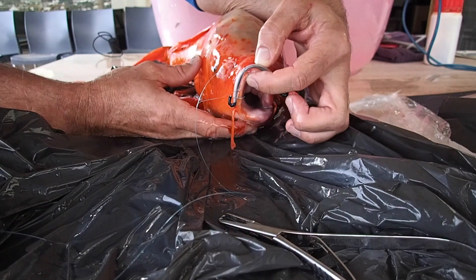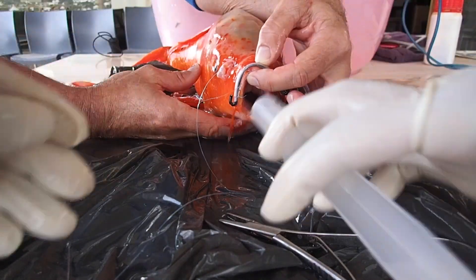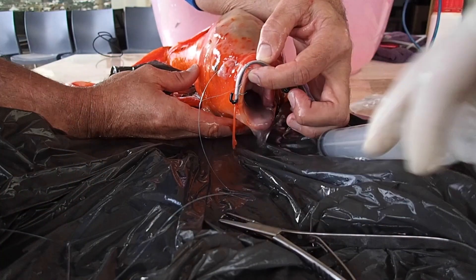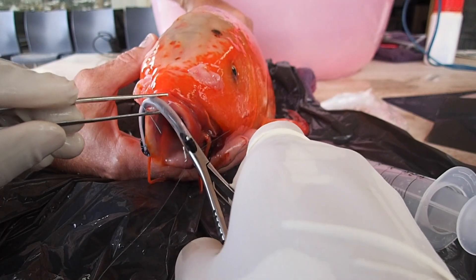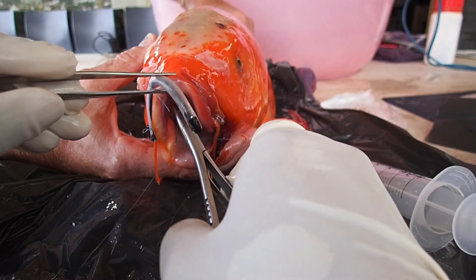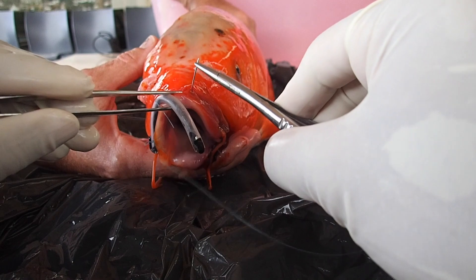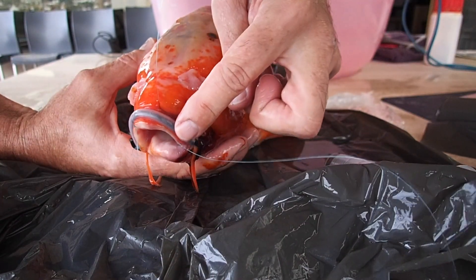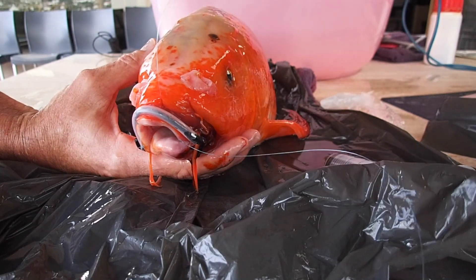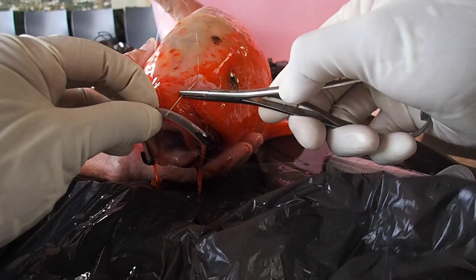Every now and then, we need to maintain anesthesia and oxygenation of the gills, so we intermittently pump either water or anesthetic. This is a very invasive procedure. As you can see, we're going to put a lot of needles and sutures through his lips — it's a very sensitive area — so to make it stress-free, pain-free and comfortable for Harry, we provide him with a surgical level of anesthesia.